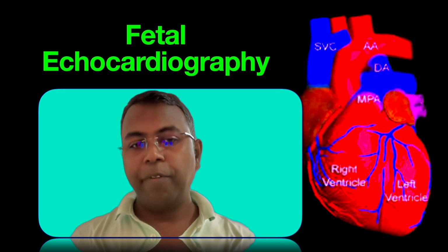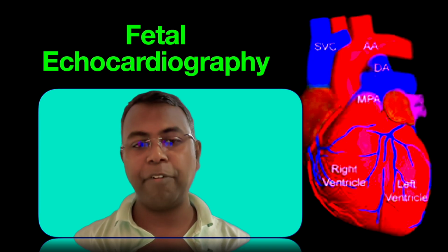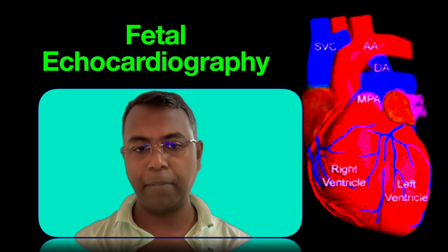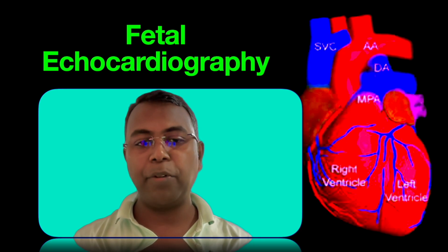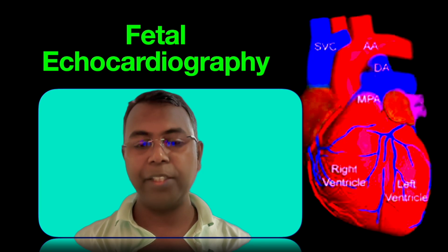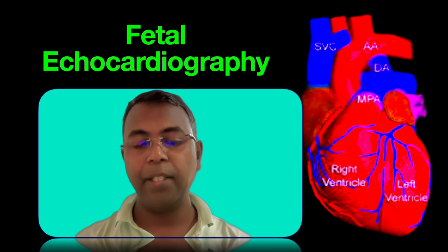Whenever you scan a fetus, maybe a normal fetus, or when it is referred as a cardiac anomaly, we always have a tendency to jump to conclusions. But I suggest whenever you get a referral for fetal echocardiography, you should always step back and stick to the basics.